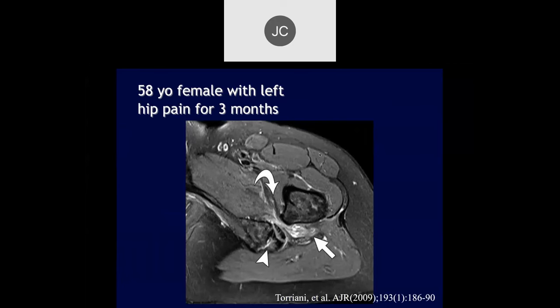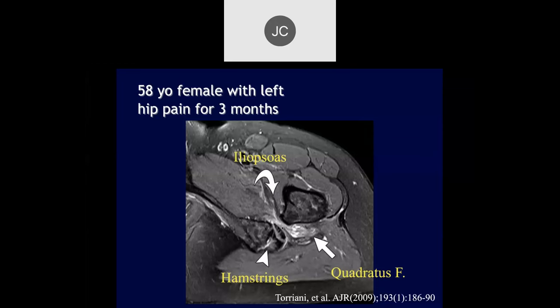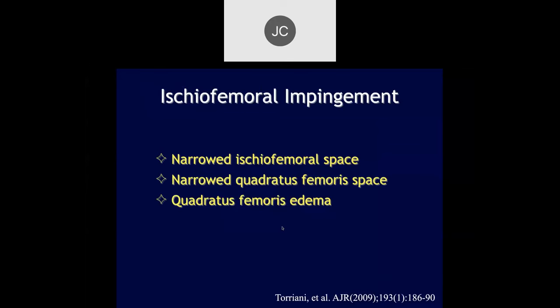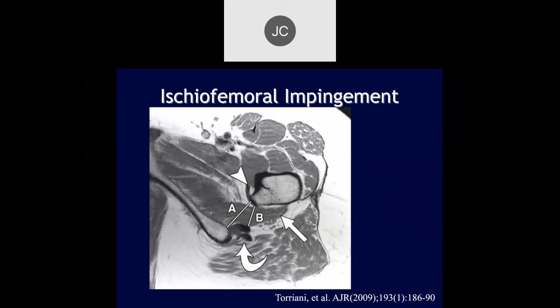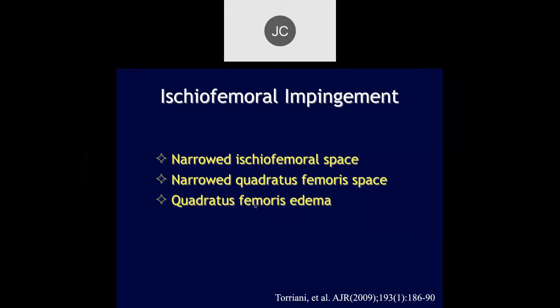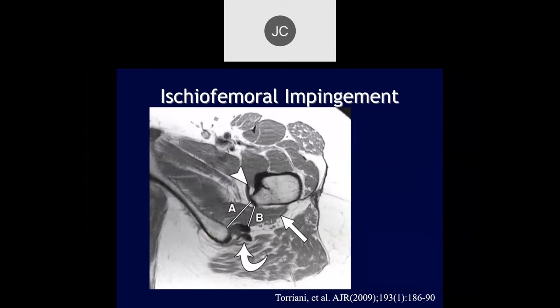Here's a 58-year-old female with left hip pain for three months — a more severe example where we can see marked narrowing between the femur and the ischium, with the hamstring origin showing thinning of the muscle and edema. What you look for with ischial femoral impingement is narrowing of the ischial femoral space, also narrowing of the quadratus femoris space and quadratus femoris edema.